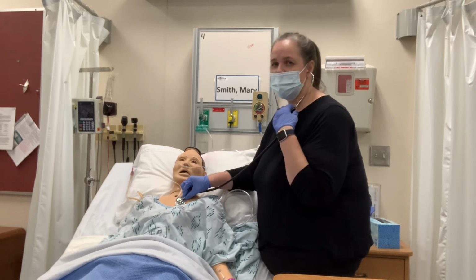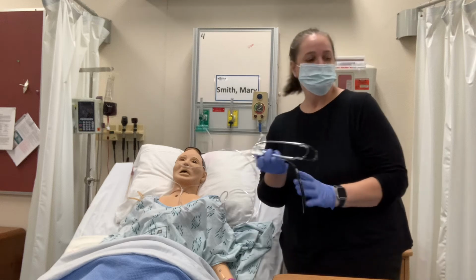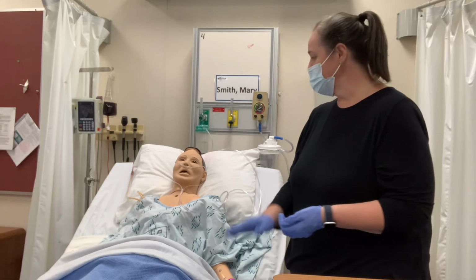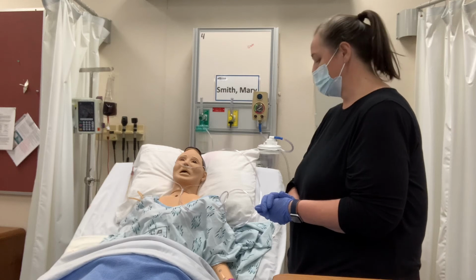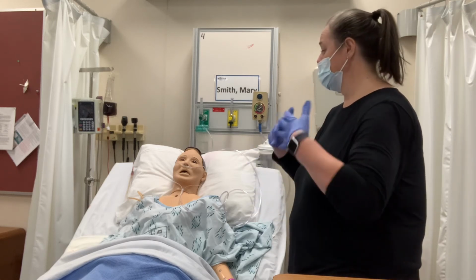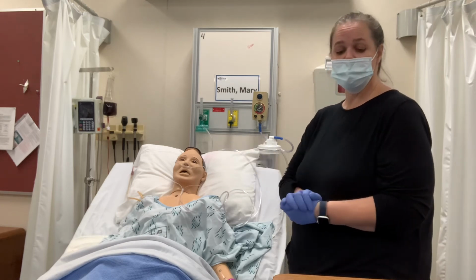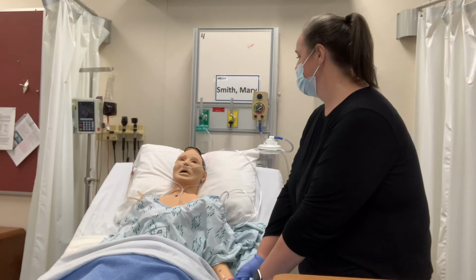So now I'm simulating time has gone by. So her respiratory rate is about 20 right now. And her heart rate is about 95, so that's a little bit better. I'm checking your oxygen saturations. It looks like your oxygen saturations are a little bit better at 94%. I don't see any signs of cyanosis. Your capillary refill is good. I'm not seeing any retractions or nasal flaring. The patient's reporting that she's feeling less short of breath than she was before, so this intervention has been effective.